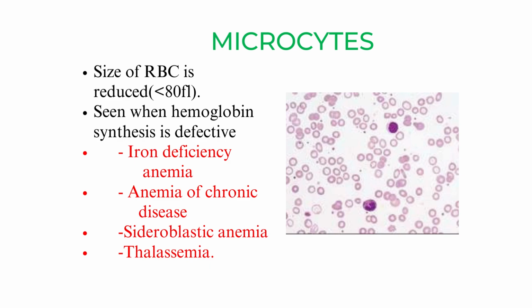Now look at this picture. You can tell we have one lymphocyte right on top. There are two WBCs visible, and the upper one is a lymphocyte. If you compare the nucleus of the small lymphocyte, this is a small lymphocyte, the nucleus is much larger than the surrounding RBCs. So this is microcytic. So it is not just MCV that you're relying on, but you also correlate it with PBS. Okay.